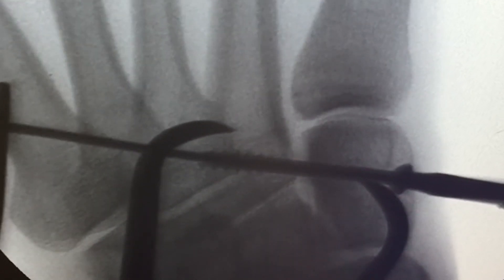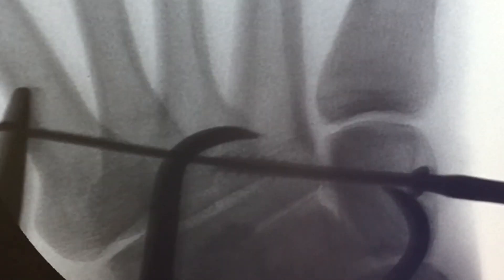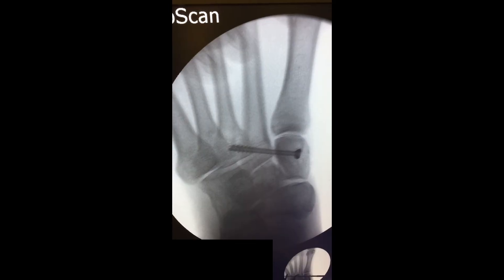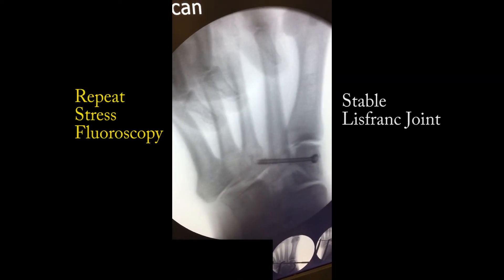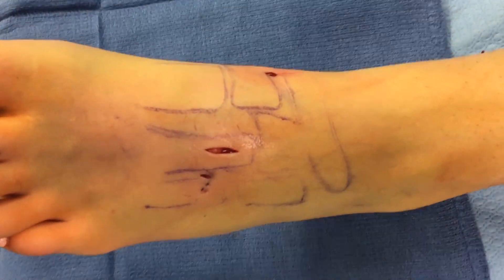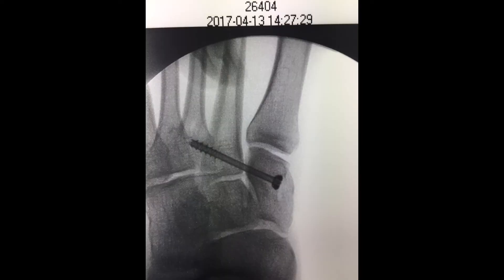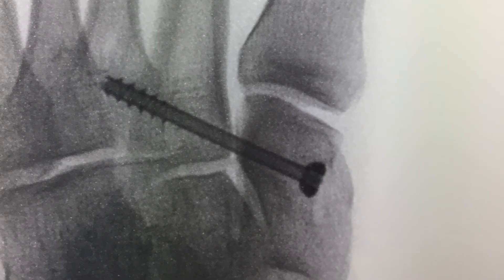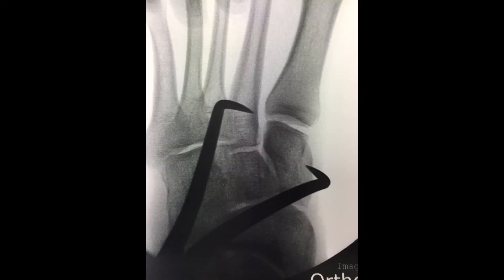The reduction is confirmed under fluoroscopic guidance, confirming that it is anatomically positioned, and repeat stress fluoroscopy should be undertaken, ensuring that the Lisfranc construct is stable and anatomically aligned in all planes. This entire procedure is done through four small incisions: one for the screw medially, one for a small dorsal incision for the reduction, and two incisions for the screw and pin positioning. An anatomically stable reduction can be obtained, allowing good results of this injury.